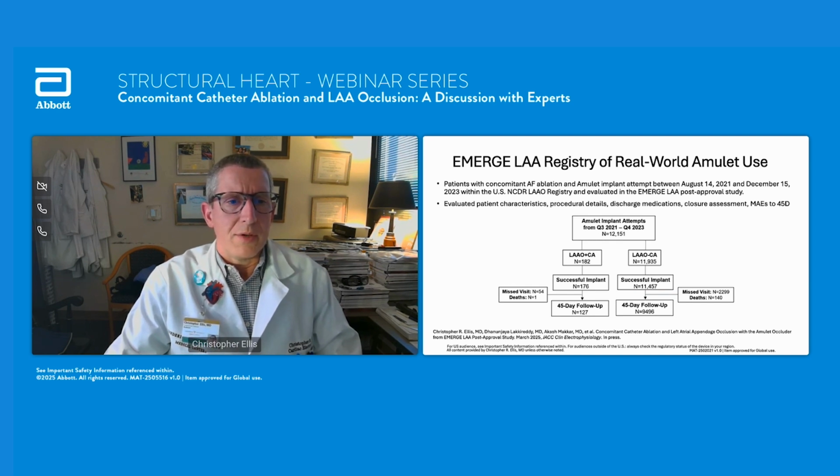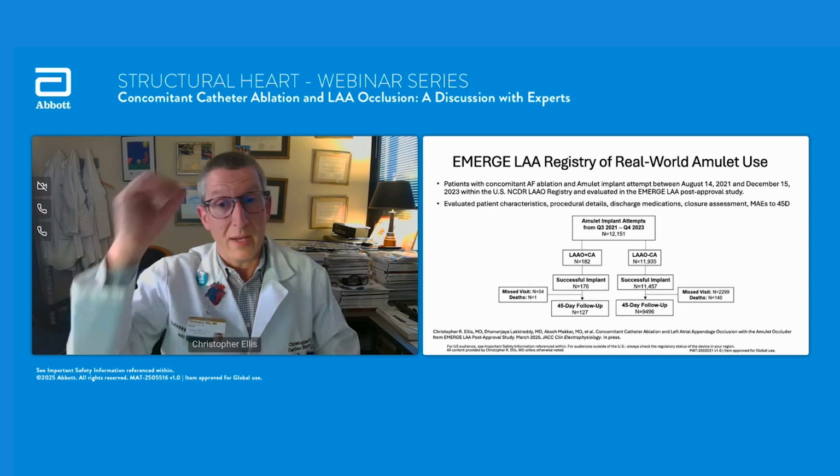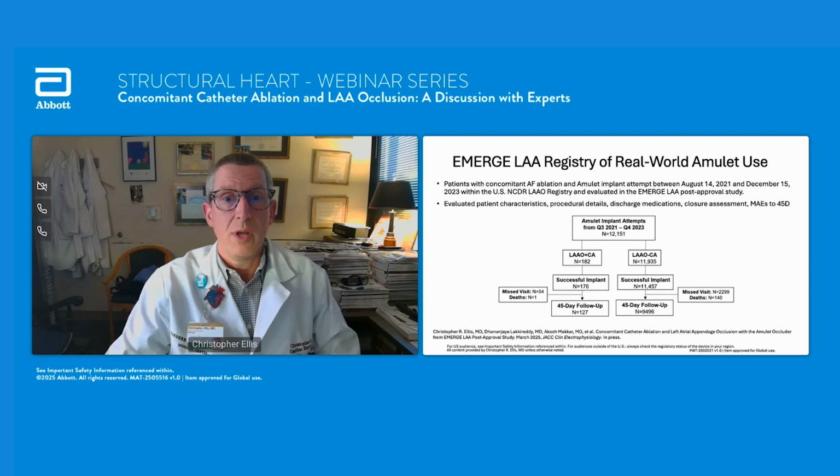The first thing you'll notice is that out of 12,000-plus Amulet implant attempts, there really was a paucity of concomitant procedures. We'll get into this in a bit, Frank, but at least 15% of patients that I'm ablating now are getting a concomitant closure, and it's an indicated closure. So I would think there would be more like 3,000 patients with concomitant closure out of 12,000 implants. But here we're only looking at 182, and that certainly reflects that this is the early Amulet experience.